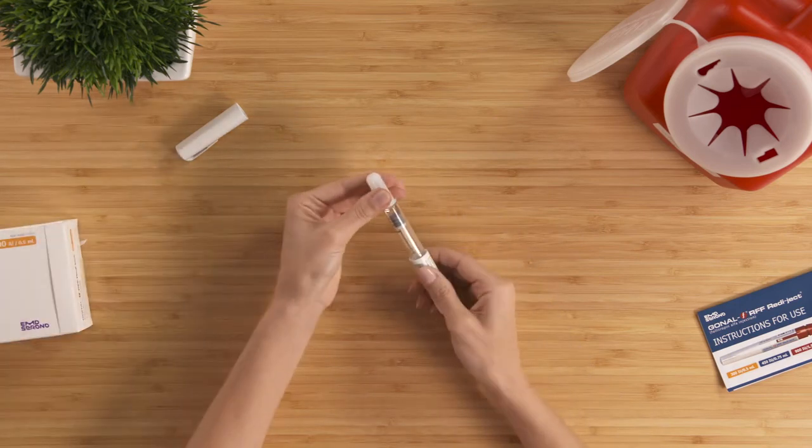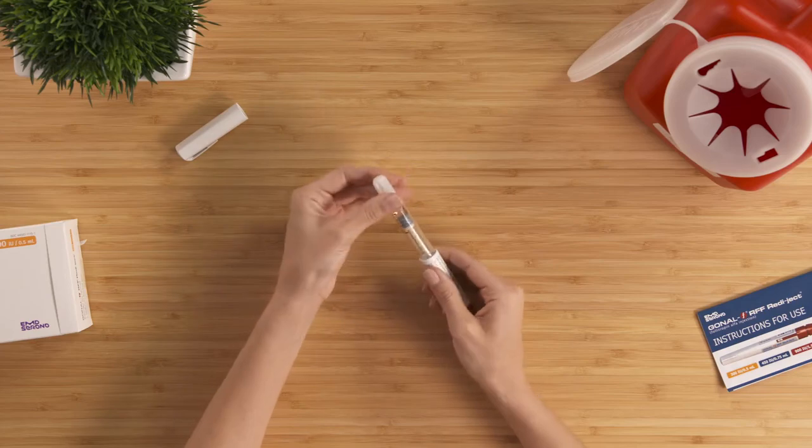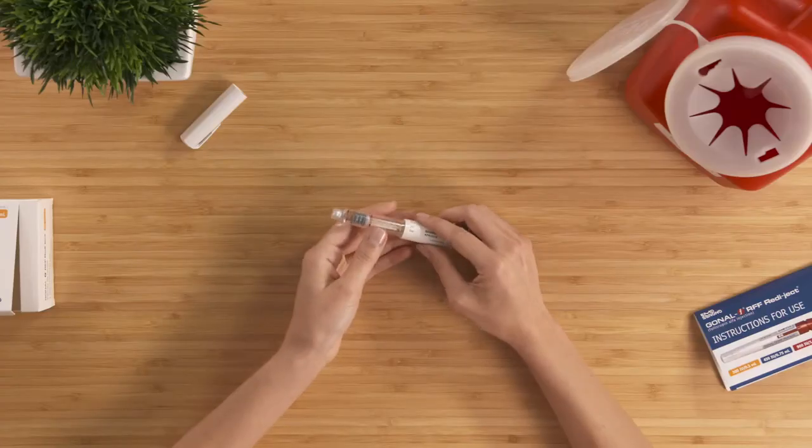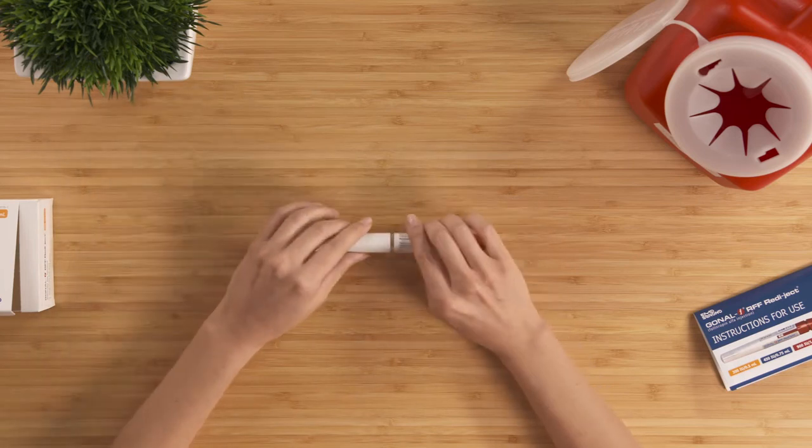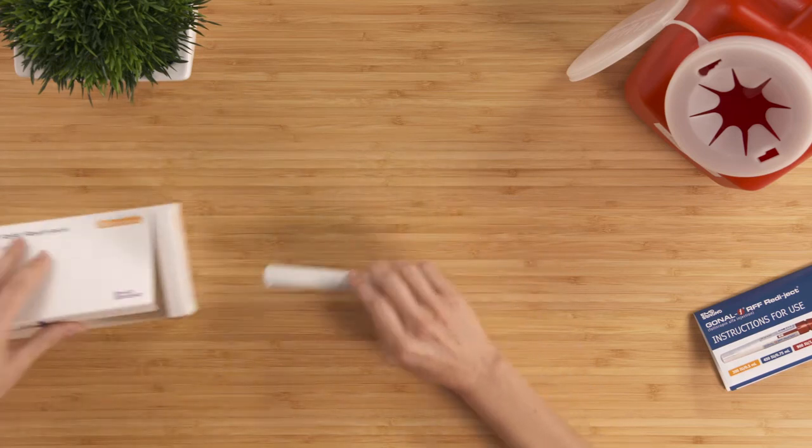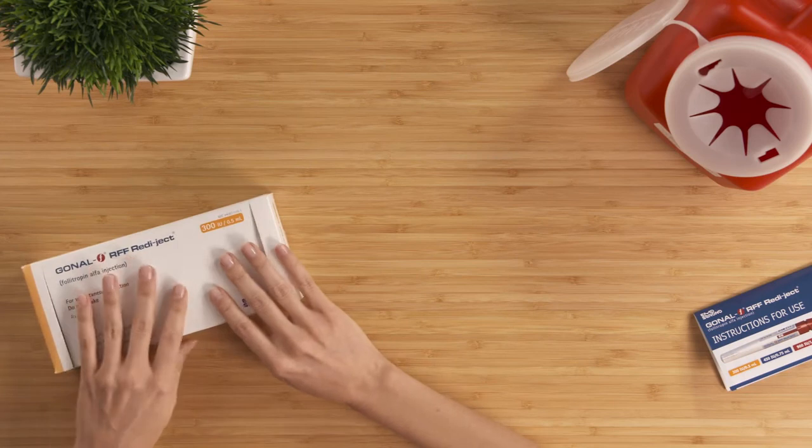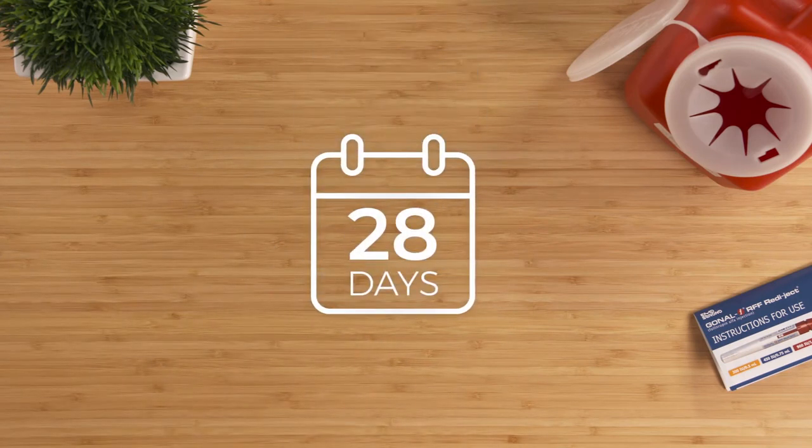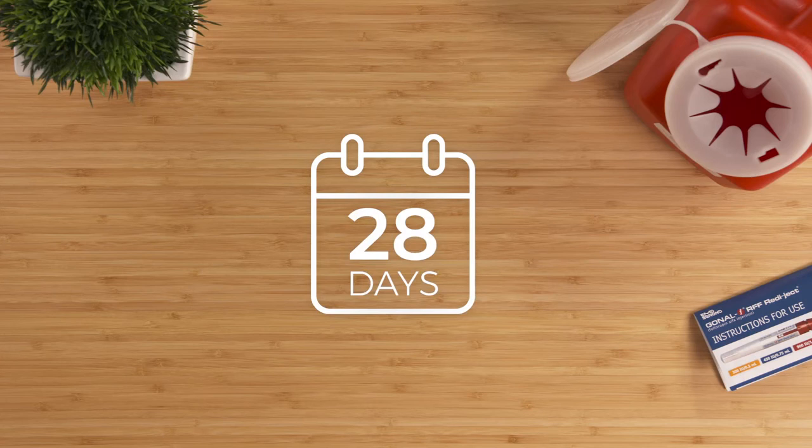Twist off the capped needle and throw it away in an approved sharps disposal container. Like this one, here. After removing the needle, recap the pen. If you have medicine left in a pen after injecting, store it in the refrigerator or at room temperature for up to 28 days. If the pen is empty after your injection, throw it away in the sharps container.